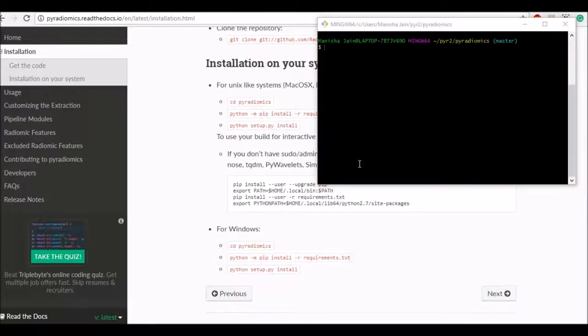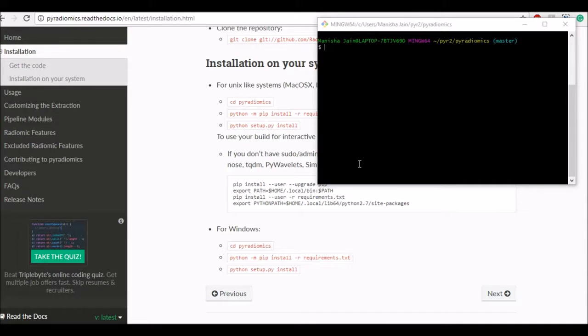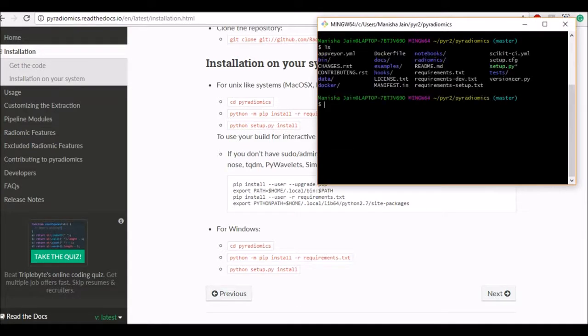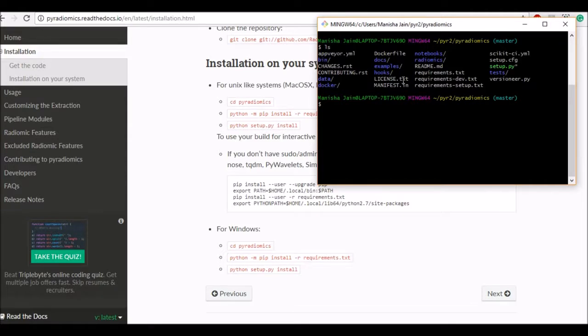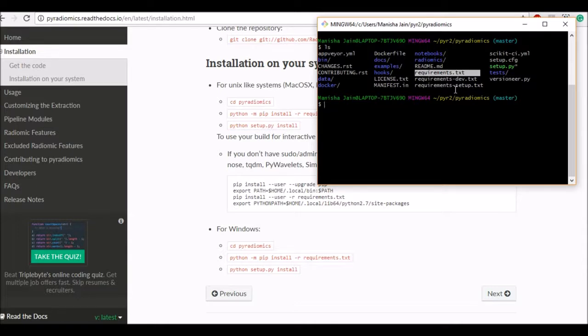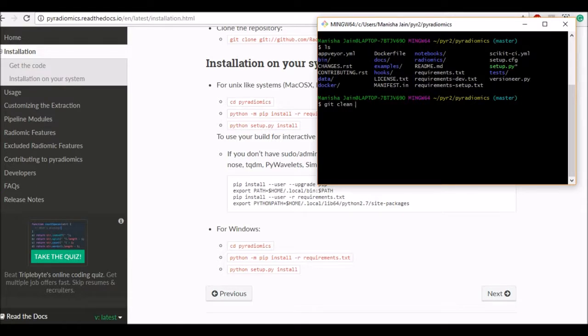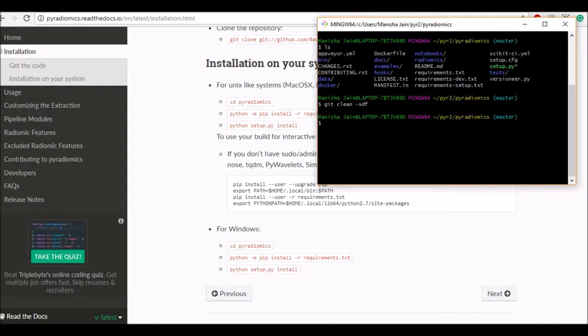Once you have cloned the git package we'll go into the directory and look for the files. So as you can see PyRadiomics has downloaded all the files needed. One of the important files is requirements which specifies how to install the package. So before we install anything I want to make sure I don't have any previous compilations or anything so I'll run the git clean using git clean xdf so it cleans all the previously compiled files. So we'll start fresh here.